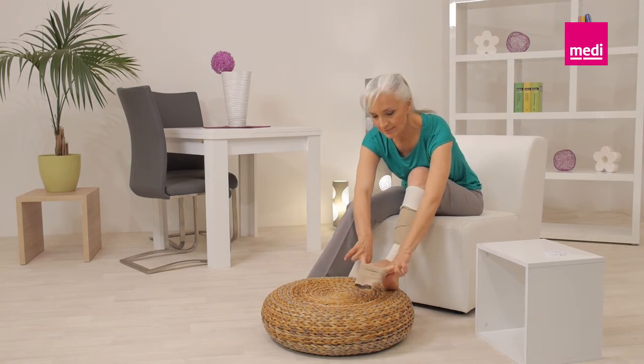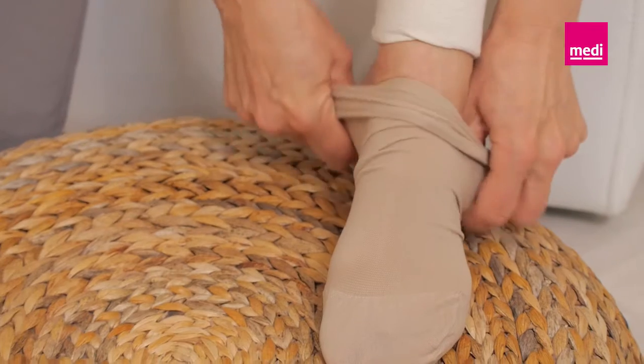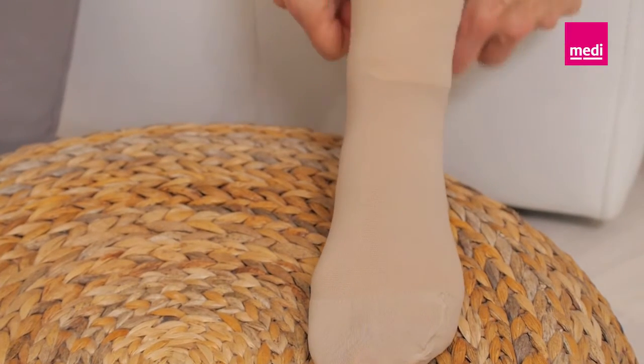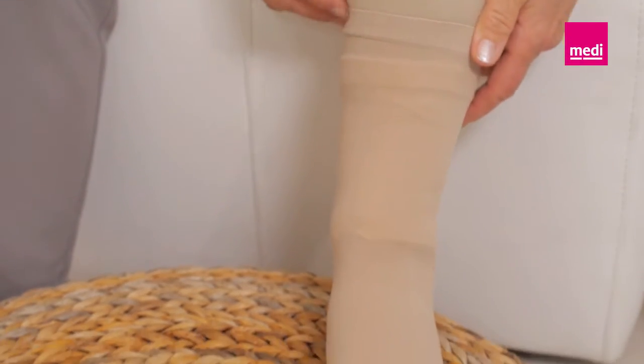Slide the Circate Compression Anklet onto the foot and ensure that it is pulled high enough so that it overlaps with the Circate Juxtalite. Ensure that there are no wrinkles in the anklet or the undersleeve.